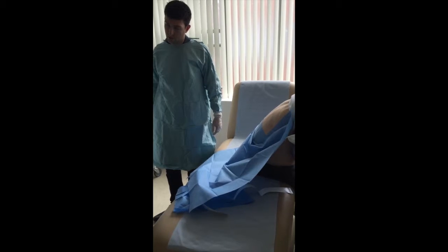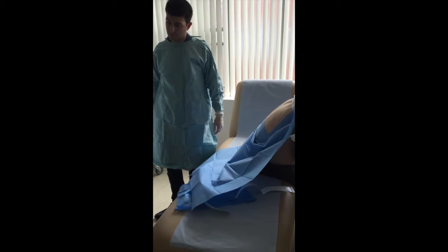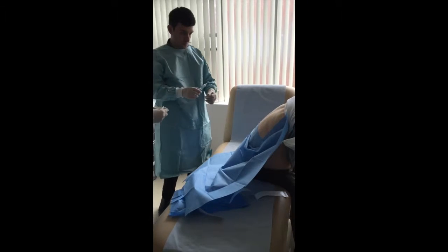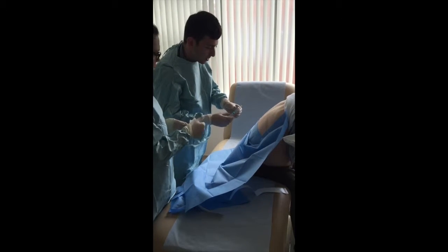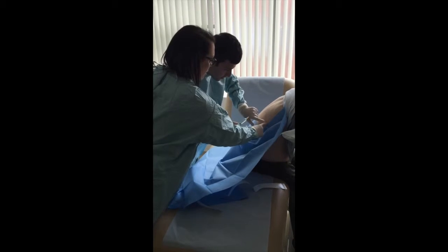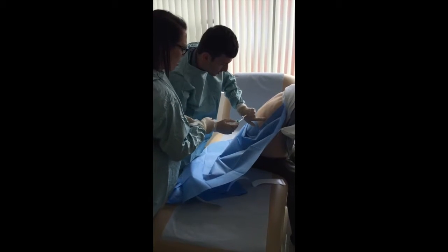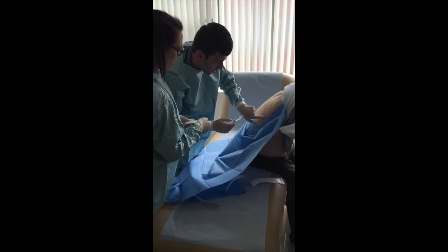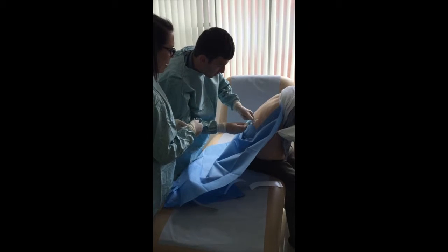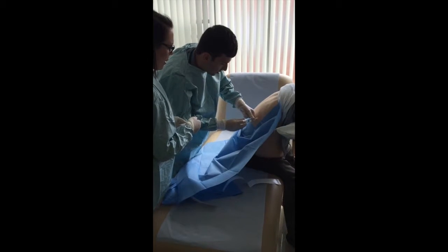What we're going to do now is just start to give some local anaesthetic. So if you want to give some subdermal lidocaine into the 4 quadrants. Yep. So just have a good feel there now that we've cleaned the skin. So what you're going to do is give it at 12 o'clock. Quite a shallow injection. It's like a skin bleb. Right, sharp scratch.